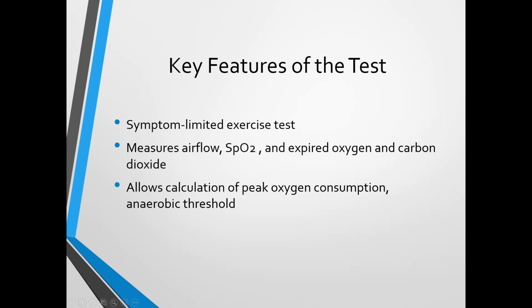It can speak to the individual's nutritional status and perhaps be an indicator that the diet should be altered, perhaps to have less carbohydrate for a COPDer, because the respiratory quotient is significantly outside of the normal range. I don't want to go on a tangent with respiratory quotient, but I do want to say that the relationship between VO2 and VCO2 is the respiratory quotient, and it can render some very valuable information to the team that's actually monitoring the patient.